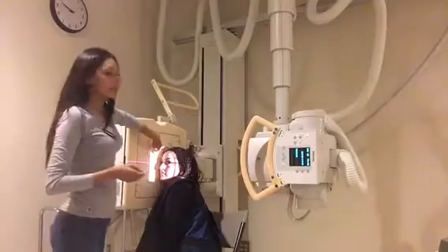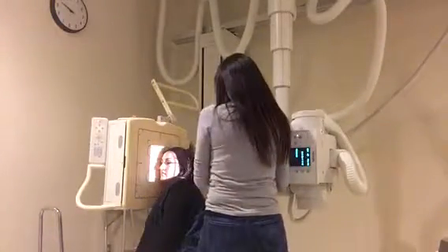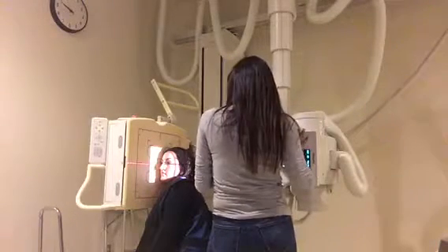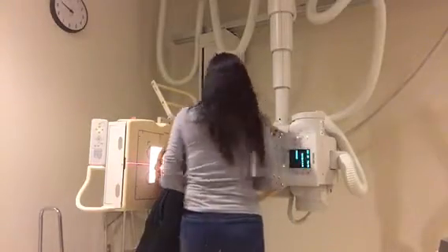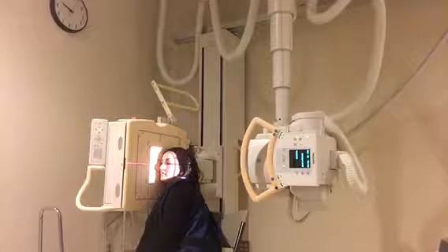My right marker indicating that it's my patient's right side. So go ahead and hold still. So go ahead and take a deep breath in and hold it, x-ray.